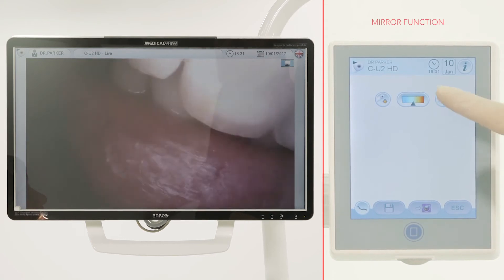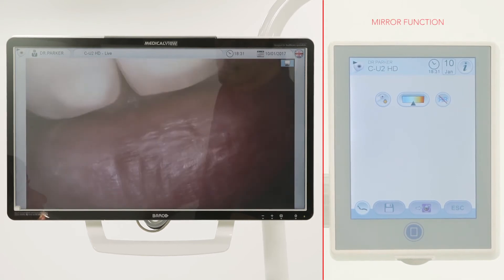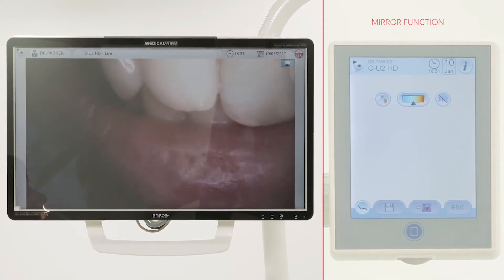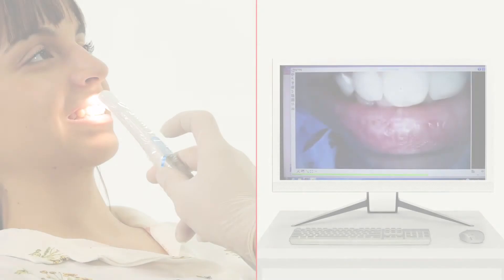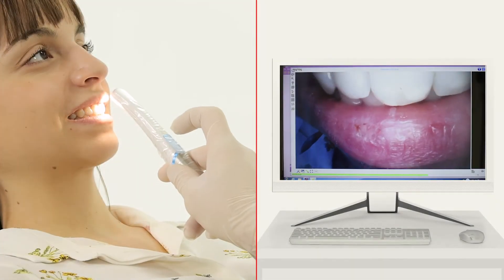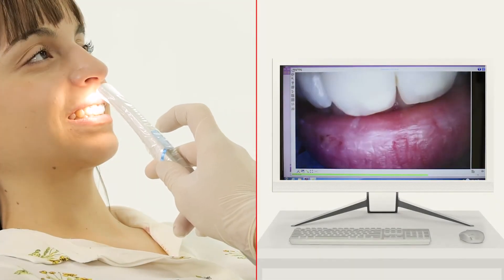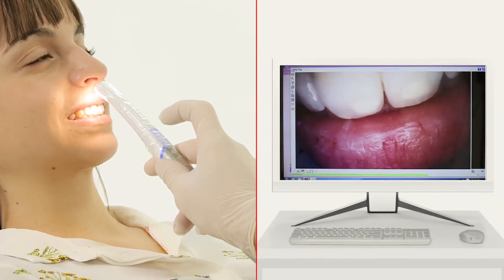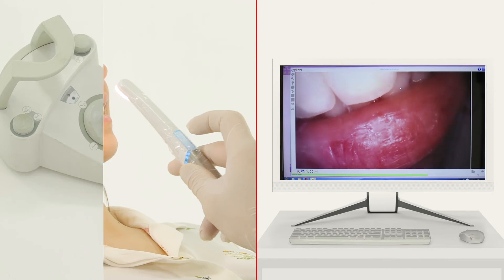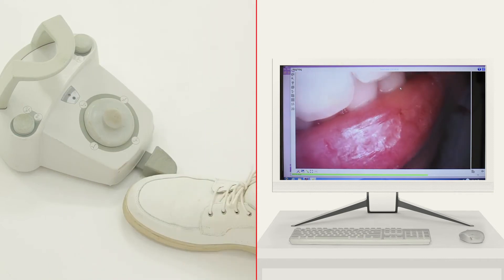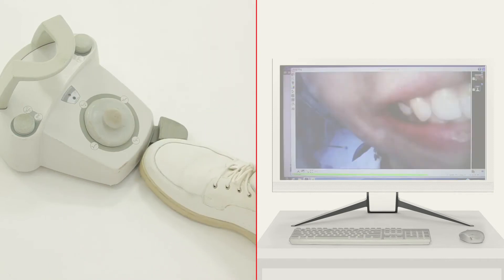Enable mirror function. Freeze frame shots can be acquired in two ways: from the handpiece, or from the foot control.